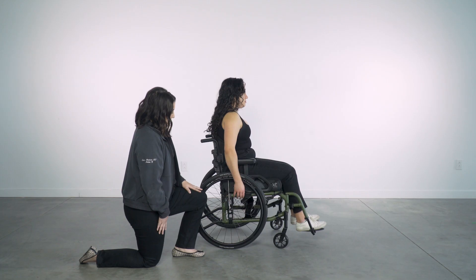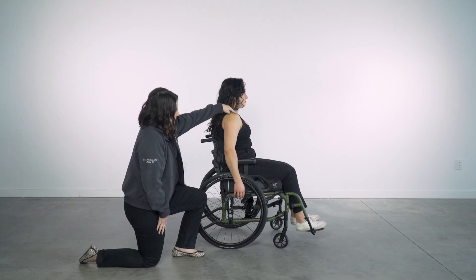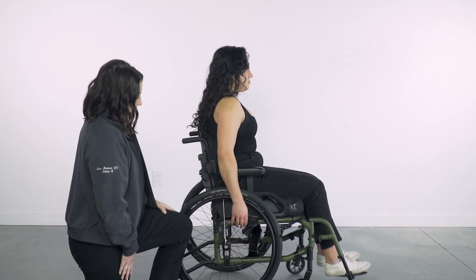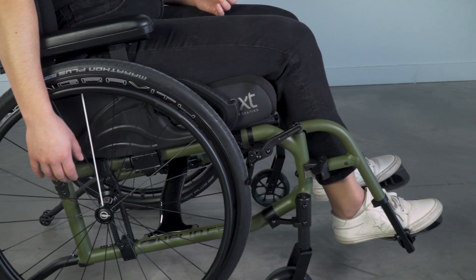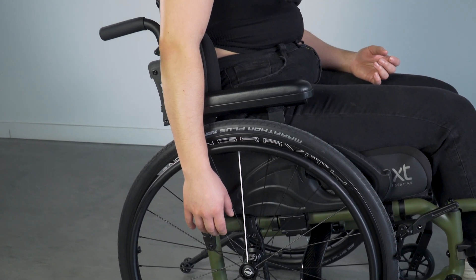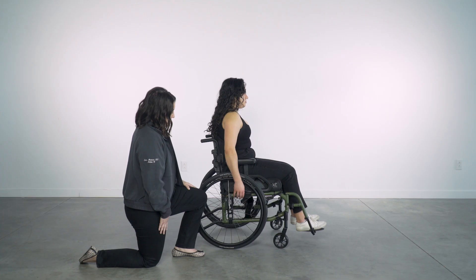Ideally, that line lands at or in front of the client's shoulder. If it is behind the client's shoulder, this is a more stable but less efficient setup. If it is in front of the client's shoulder, this is more efficient but could be less stable. Use your clinical rationale to determine what is ideal for each client you assess.